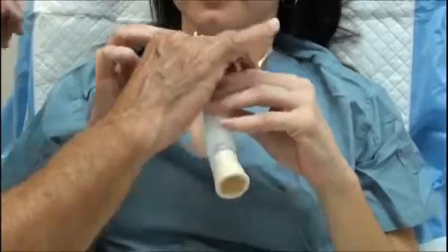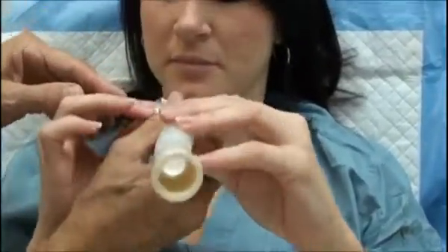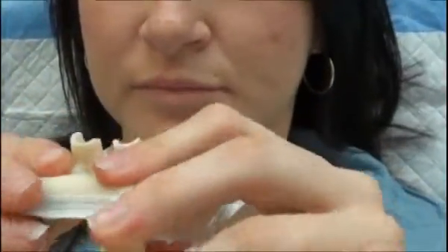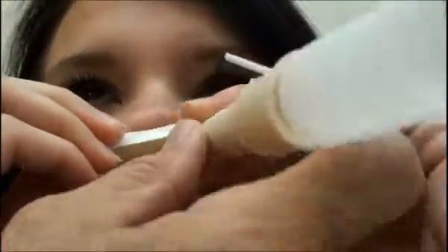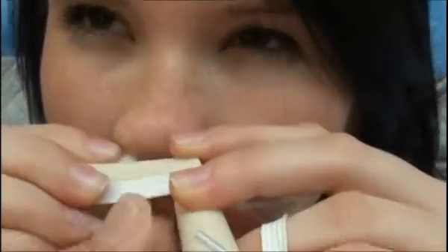Now let's put it in your nose. You can wiggle these things apart a little bit and just get them started in your nose. You shouldn't have to use a lot of pressure or anything. That's pretty good.